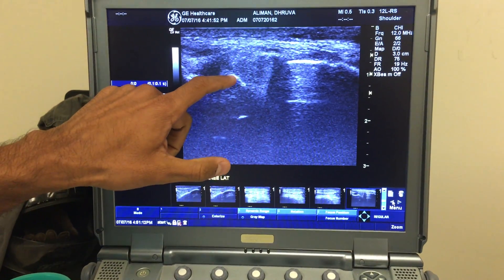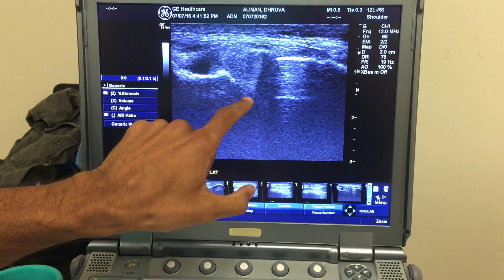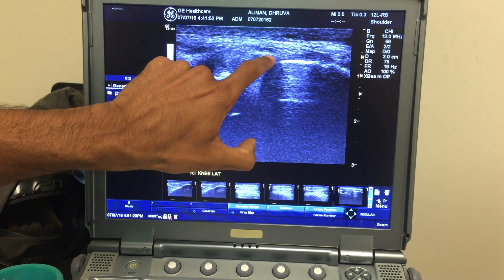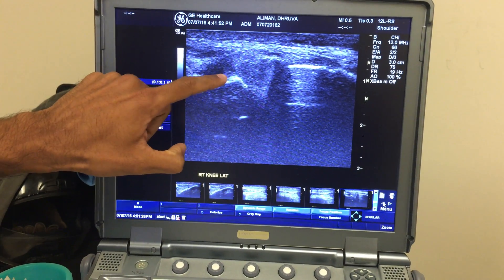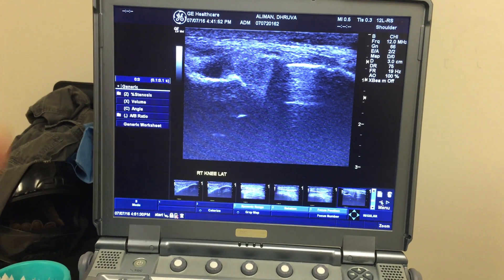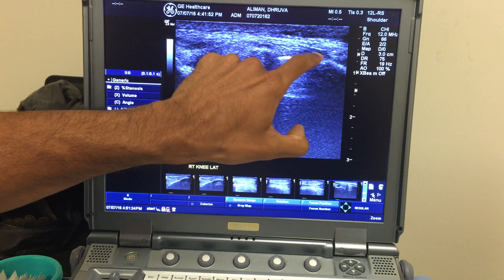So bone — sharp white, bone sharp white. Your meniscus tissue sits in this V, this crevice. This is the border of your meniscus tissue — it should be congruent with the bones. But this is bulging out. All this black is inflammation.